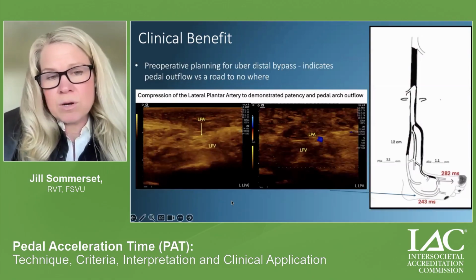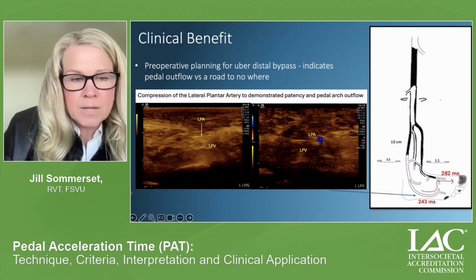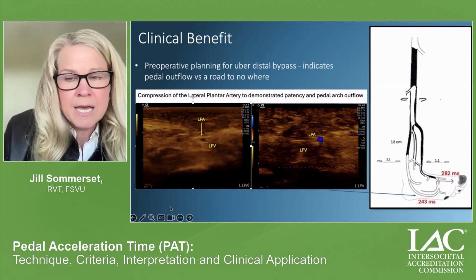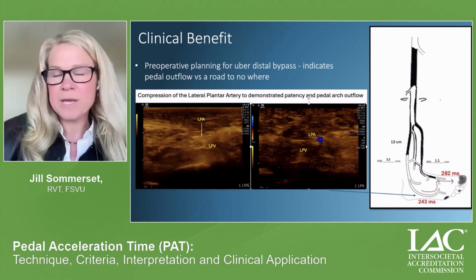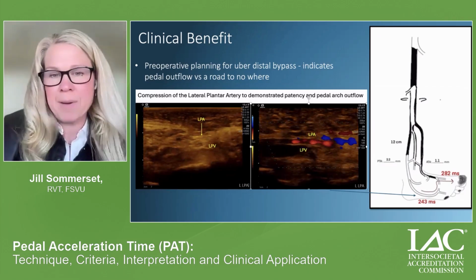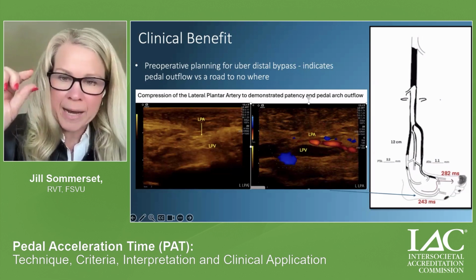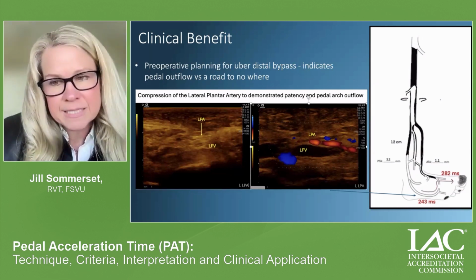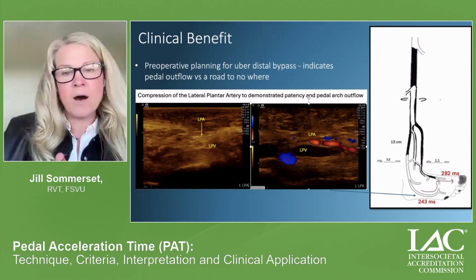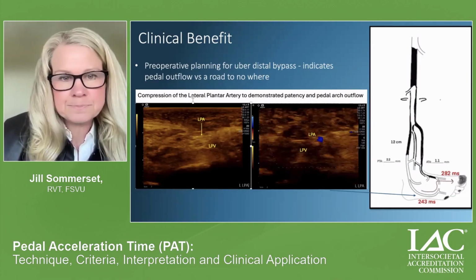I do like it for pre-planning for a long distal bypass for vascular surgery colleagues to say, is the pedal arch open? Do we have outflow if we're going to do a long distal bypass? Yes, we can definitely assist with the distal target for bypass, the diameter, the calcium burden, but we can also have the confidence to say this patient has outflow when we do our distal anastomosis.